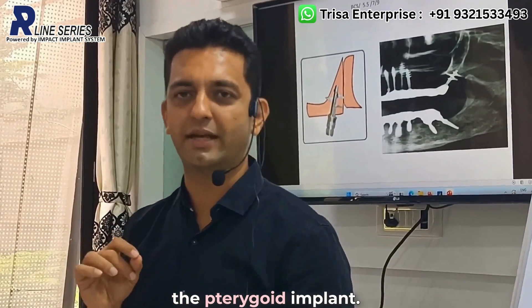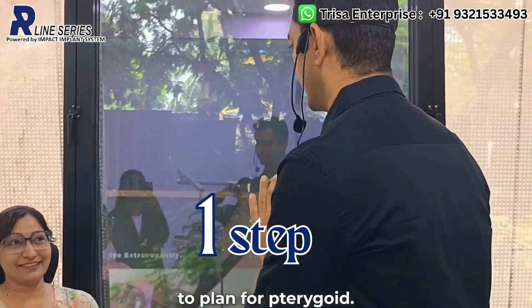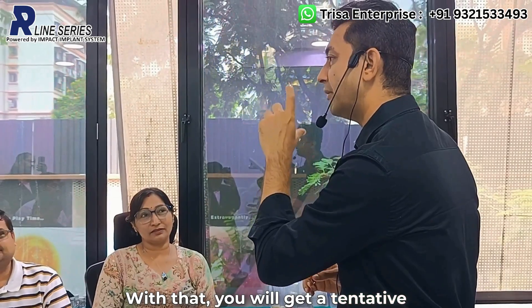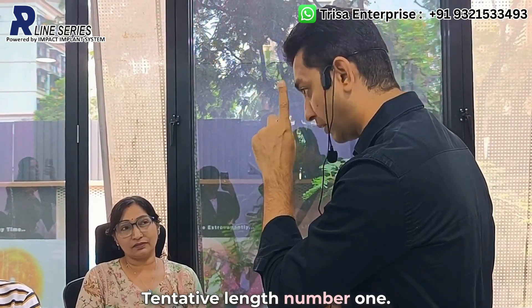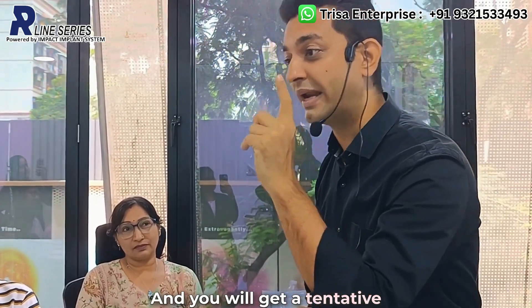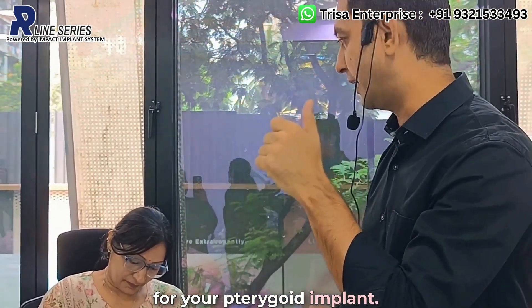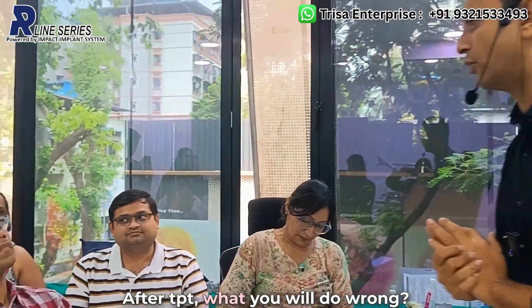First step: treatment planning using a template (TPT) for pterygoid implants. From this, you will get a tentative length — not a final length — and a tentative start point. These two parameters, length and start point, are very important for planning your pterygoid implant. That is point number one.